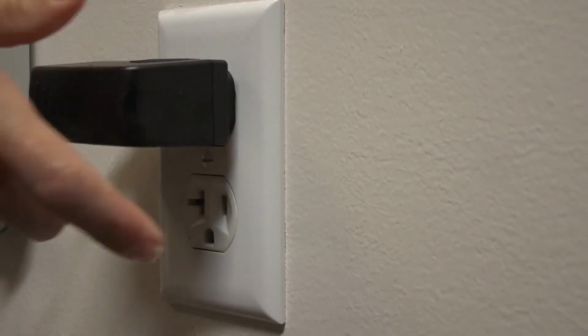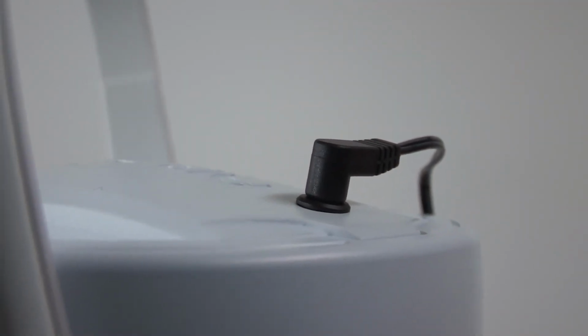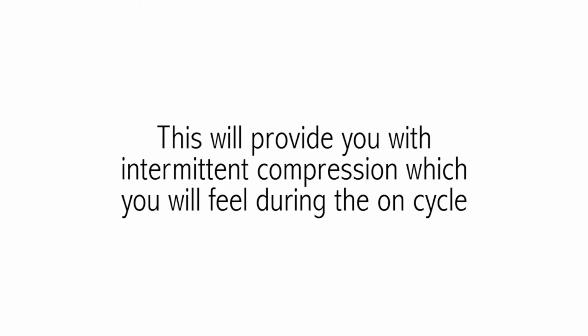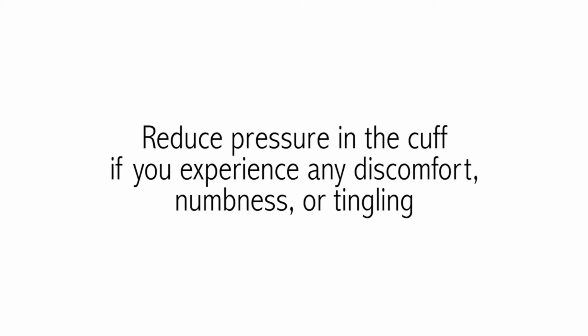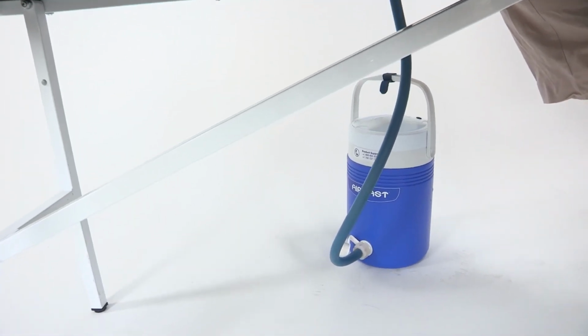4. Then simply plug in the power supply to turn on the unit. You will hear the motor turning on and off about every 30 seconds. This will provide you with intermittent compression, which you will feel during the on cycle. While the unit is running, remember to never lift the cooler higher than 4 inches above the cuff, as this can cause excessive pressure. Reduce pressure in the cuff if you experience any discomfort, numbness, or tingling. To do so, simply lower the cooler below the cuff.